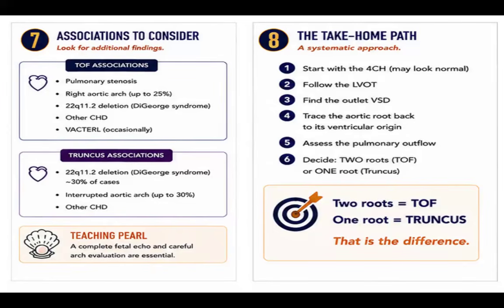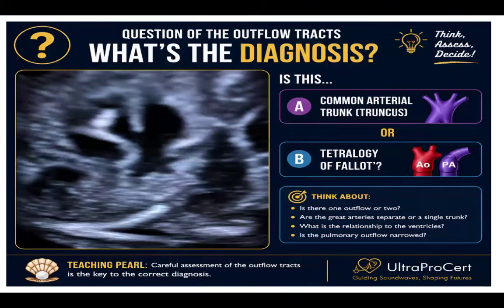Okay. Now let's look here. What's the diagnosis? Okay, we're looking at this picture. Okay, and if you look here, we see there's a VSD.